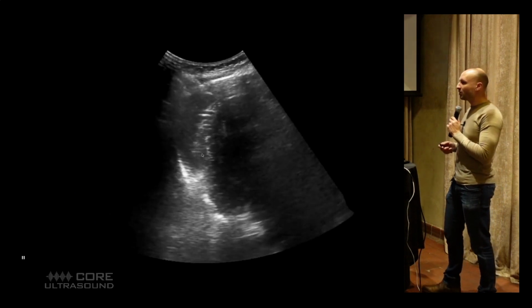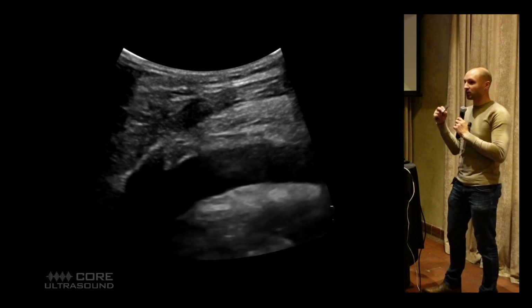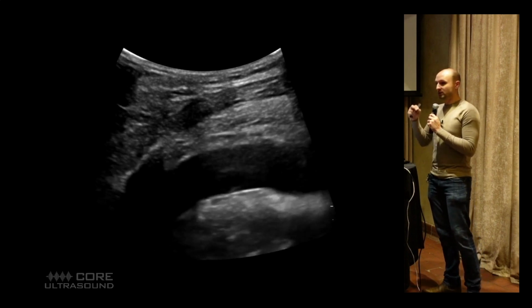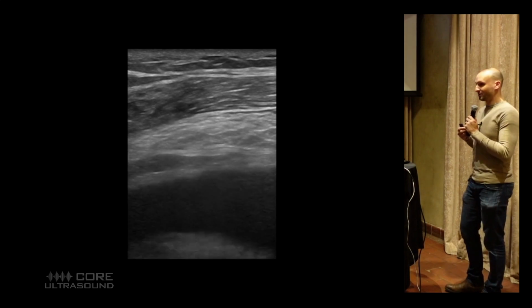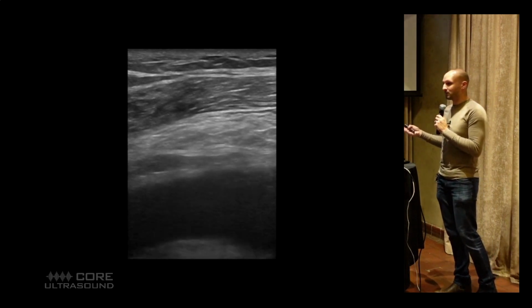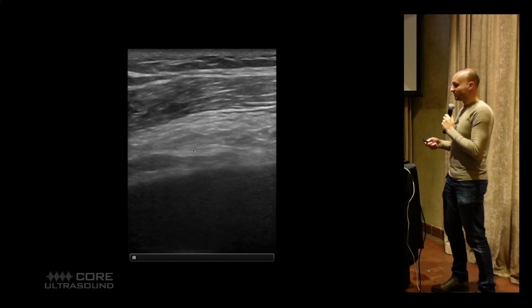Decrease the depth, right? You don't need to see anything but the most superficial border of the heart to do this. And when you decrease the depth, you're actually gonna improve the image resolution of your needle tip at the pericardial sac. And also, just use your linear transducer. This is a parasternal view. I mean, how easy would this be? It'd be like the easiest thing to do, right? It'd be much easier than a deep peripheral IV. You have this nice sac to put that needle into to drain it.